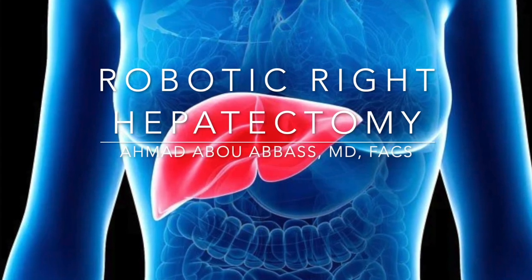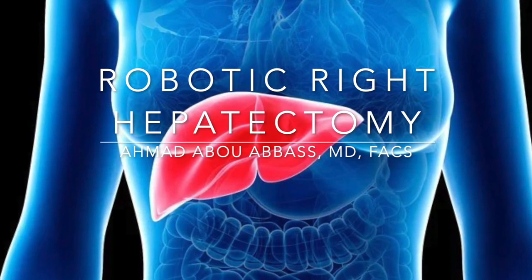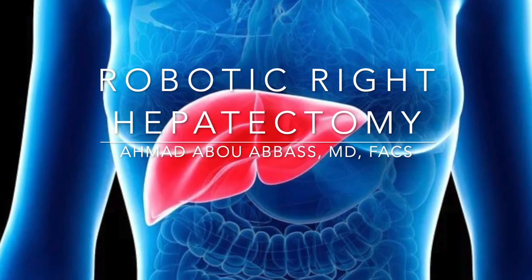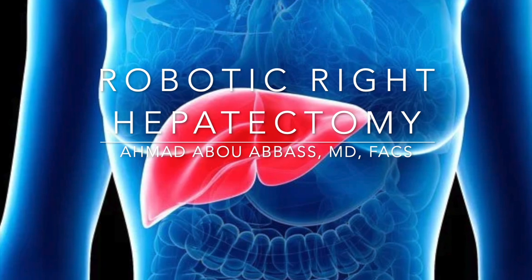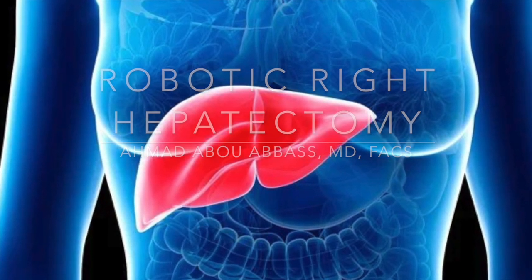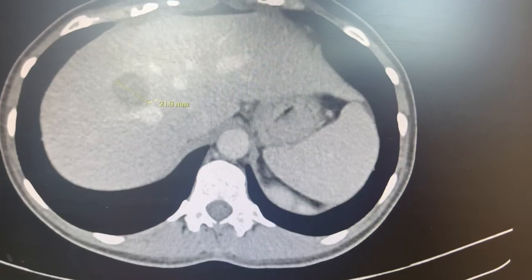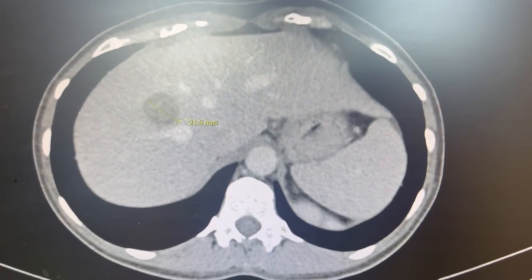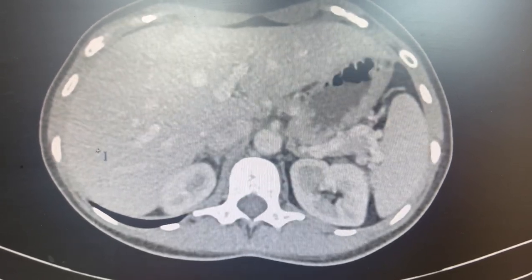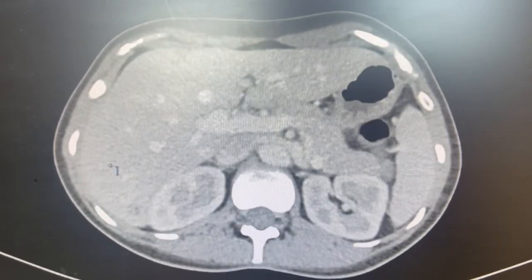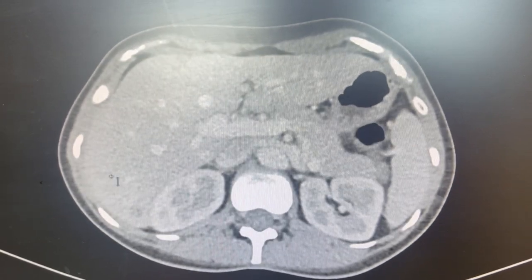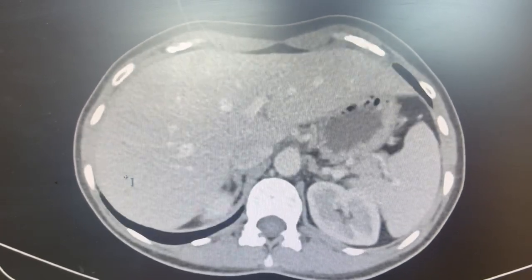This is a robotic right hepatectomy for colorectal liver metastases in a 40-year-old female who was diagnosed with rectal cancer and had multiple liver mets. There were four in the right lobe and one in the left segment. Patient underwent chemotherapy — this is pre-chemo. All the tumors shrunk but were still persistent. She also had an MRI that didn't show any other lesions.